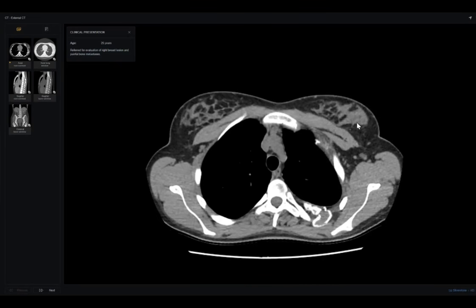I think the examiner gave me an X-ray in my Viva, only an X-ray of the knee, and it looks like there is a sclerotic lesion. Within the X-ray, I described everything for him, in MRI, in nuclear scan, in management. I think he didn't give me the next examination like this, because everything he would ask about, I answered before he talked.